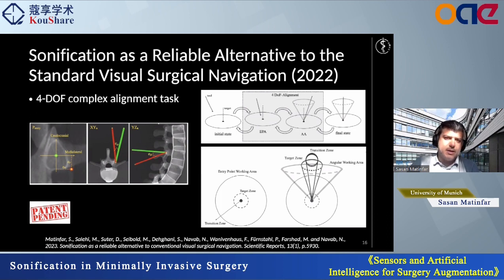The last work I want to show you is about tool alignment sonification to guide surgeons to a predefined target trajectory. One of the challenges in sonification is data complexity, and the idea here was to model the alignment task as a 4-degree-of-freedom task, and we were interested to know how we can present this complexity of 4-dimensional alignment through sound.